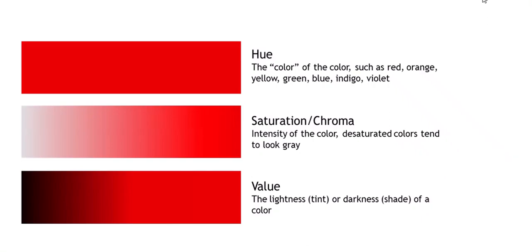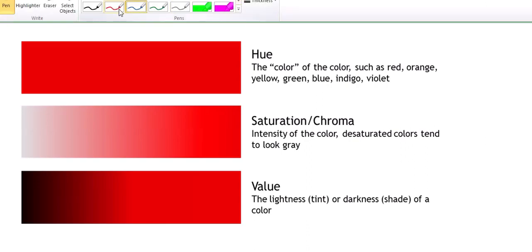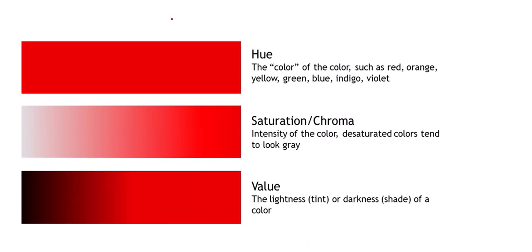The next comes the color for the anterior teeth. So how would you select the color for the anterior teeth? Before selecting the color for the anterior teeth, there are some basic concepts about color that you should understand. What are those? The first is the hue, second is saturation, third is value, and fourth is translucency.